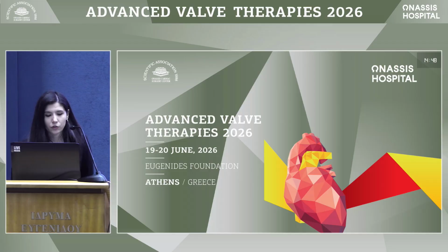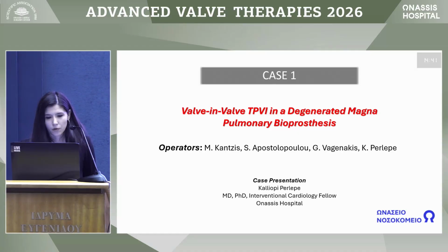Good evening once again. And instead of one, I'm going to present you briefly two interesting cases of transcatheter pulmonary valve implantation. Unfortunately, I don't have a live video, but I will try to give you a precise image of the procedure using angiographic images.